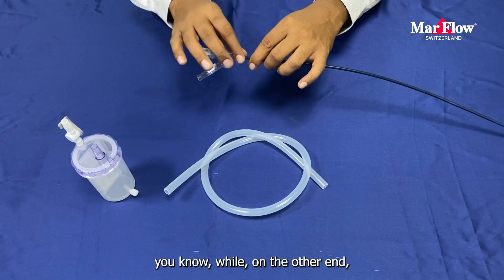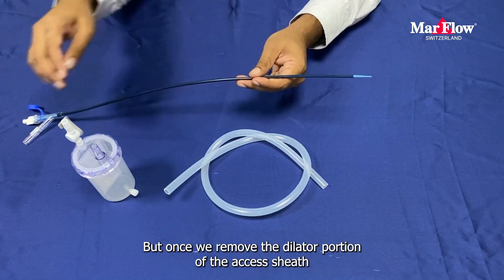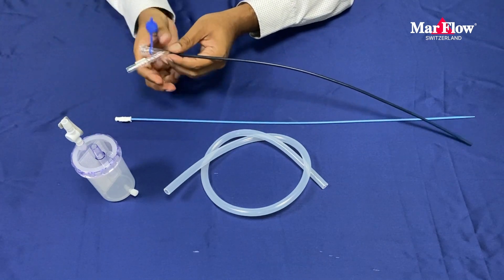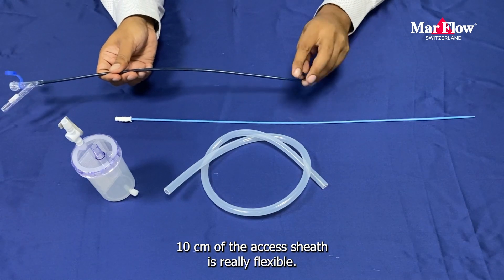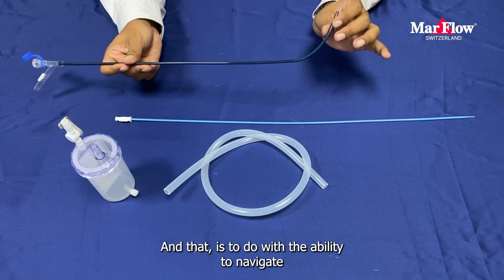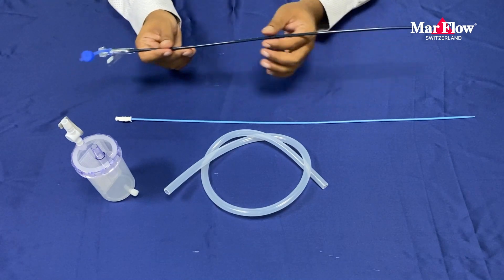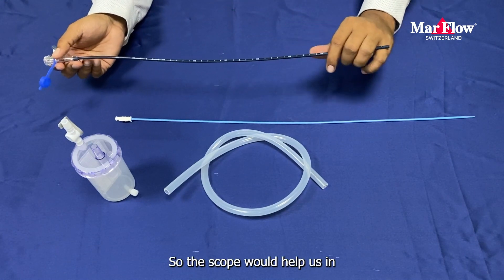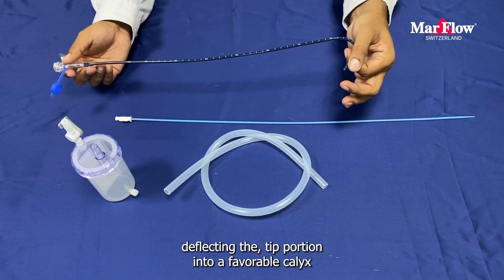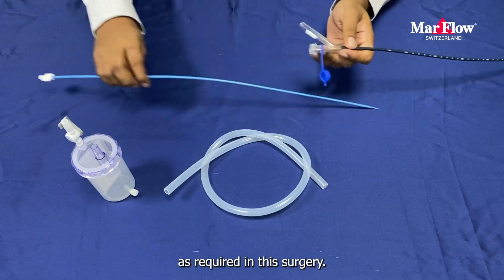On the other end, at first instance it looks all the same, but once we remove the dilator portion of the access sheath, we can see that the front 10 cm of the access sheath is really flexible, and that is to do with the ability to navigate into multiple calyces being provided with this access sheath. The scope would help us in deflecting the tip portion into the favourable calyces and do the required suction from those calyces as required in the surgery.